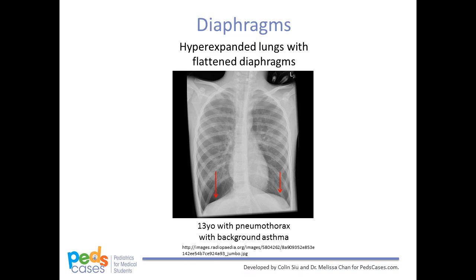Let's take a further look at other pathologies affecting the diaphragm. When examining the diaphragm, first look to see if both sides are equal, though the right hemidiaphragm may be slightly higher than the left due to the liver. The diaphragm is usually visible at the level of the 9th or 10th rib. Curving of the diaphragm may result from phrenic nerve paralysis, liver enlargement, or an abdominal tumor. Loss of clarity in the area of the diaphragm is most likely due to pulmonary collapse or consolidation. Also examine for the presence of free air underneath the diaphragm. A marked elevation of the diaphragm may be due to loss of lung volume, paralysis of the phrenic nerve, replacement of diaphragmatic muscles with fibroelastic tissues, a congenital diaphragmatic hernia, or sub-pulmonary effusion.